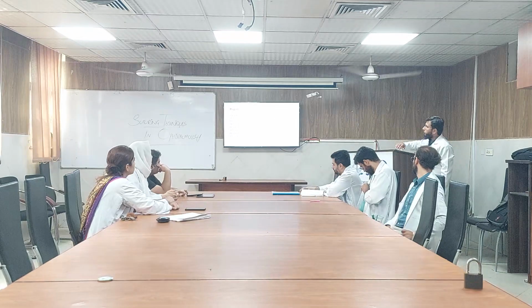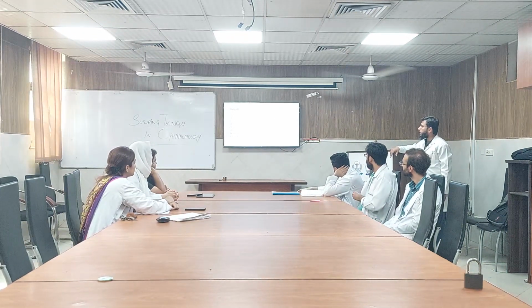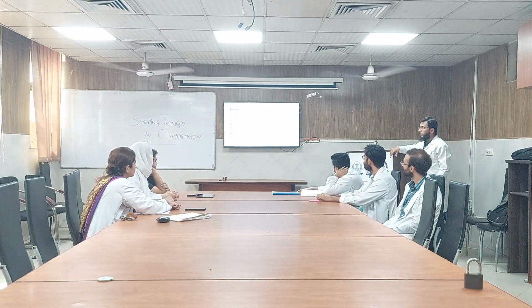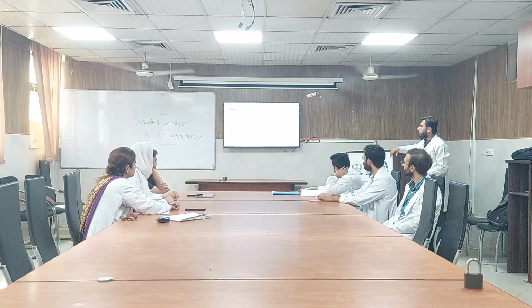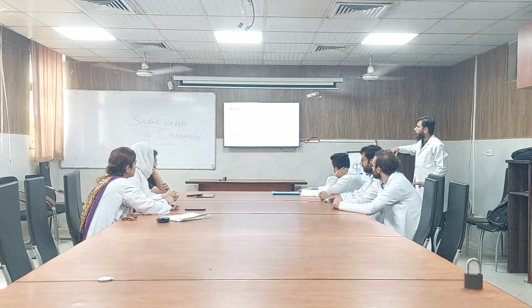Now, what are the properties of the suture? It is absorbability, tensile strength, knot strength, configuration, elasticity, capillarity, and the tissue reactivity. Now, what is absorbability? It is the duration of the suture degradation within the tissue. How does the degradation happen? It is by two methods, enzymatic and the hydrolytic.